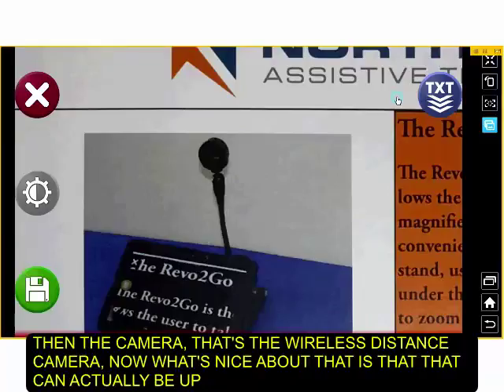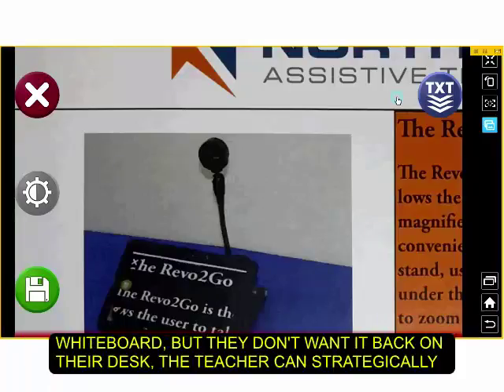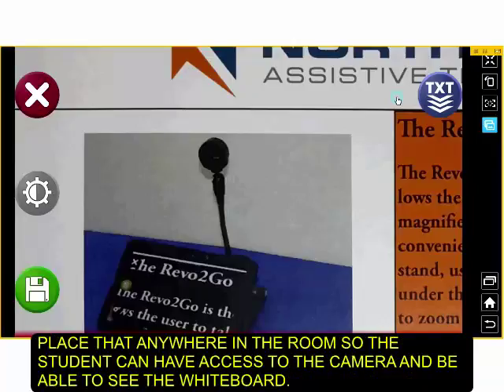Now what's nice about that is that it can actually be up to 30 feet away from the device. So if it's in a teacher situation and the student needs to be able to see the whiteboard, but they don't want it back on their desk, the teacher can strategically place that anywhere in the room, and so the student can have access to that camera and be able to see the whiteboard.